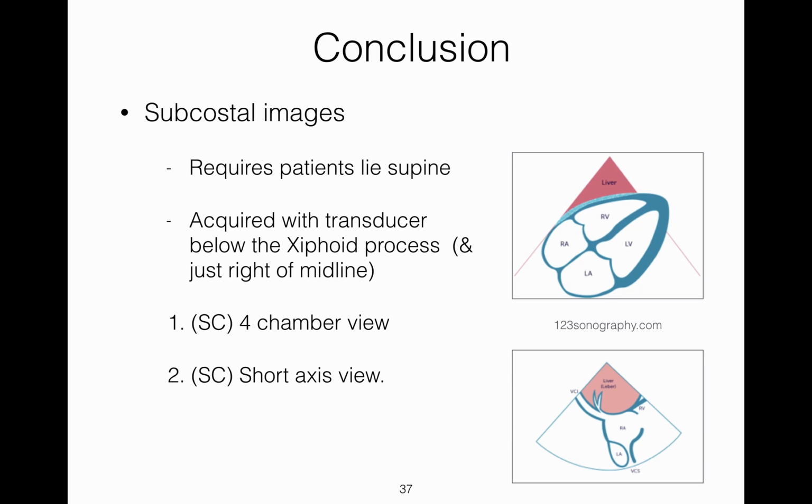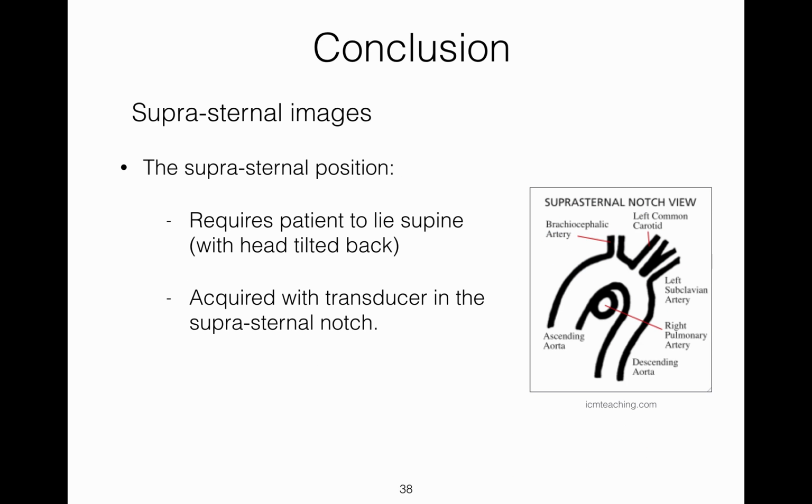Subcostal imaging was discussed next. Patient positioning, transducer positioning and orientation for 4-chamber and short-axis views. And lastly, we briefly discussed patient and transducer positioning for suprasternal imaging of the aortic arch.